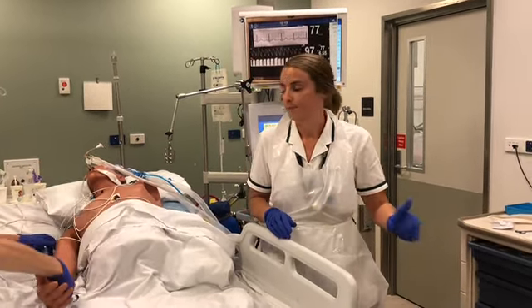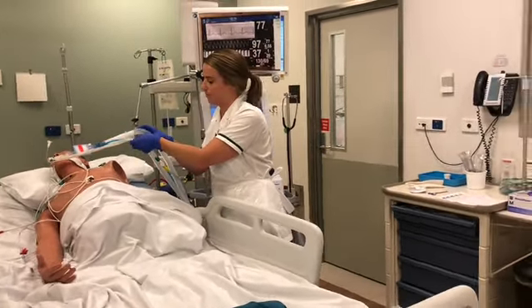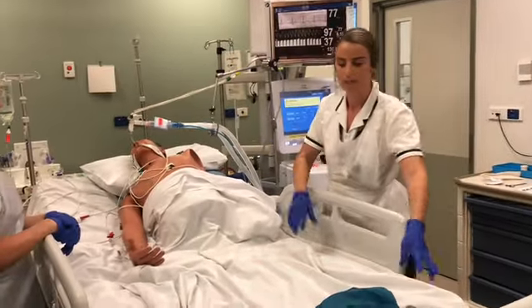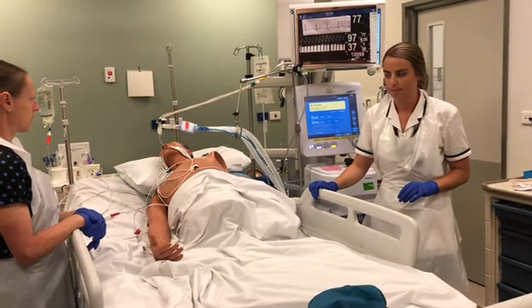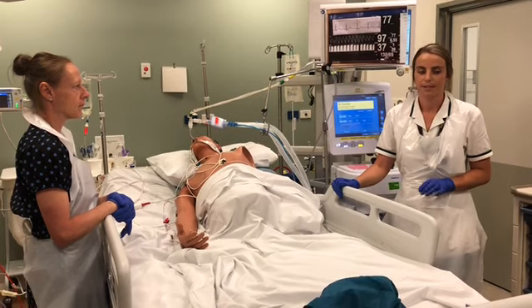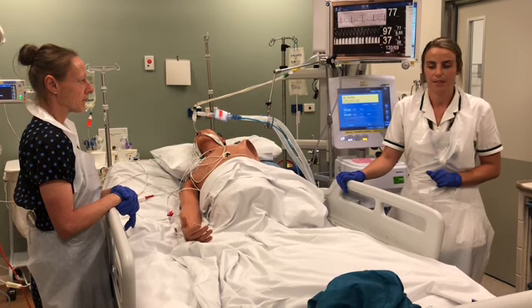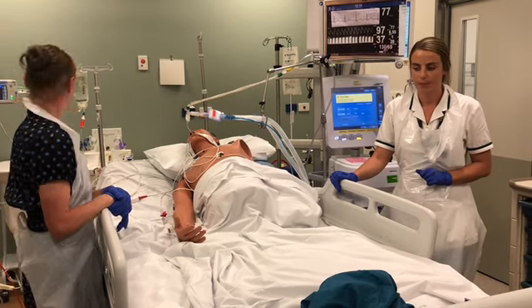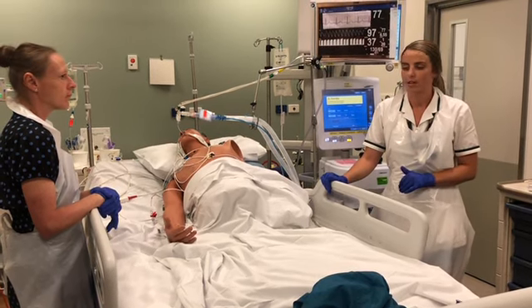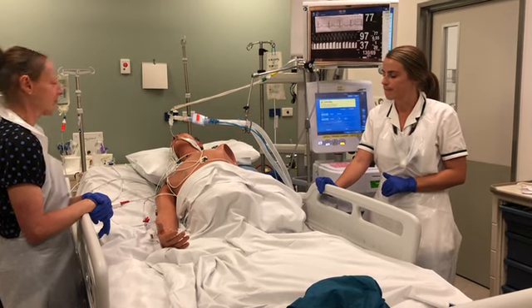Patient ID in place. Yes. Ambu bag, mask and airway at the bedside. Yes. Personal eye protection and a face shield. Yes. Ventilator alarm set. Yes. Oral suction connected and on a regular suction. Yes. Full O2 cylinder. Yes. Monitor alarms are set at appropriate limits. Yes. Electrical equipment is all plugged in. Yes. Call bell readily accessible. In this case, probably not. Not applicable. Transducers levelled and calibrated. Yes. Drug infusions checked. Yes.